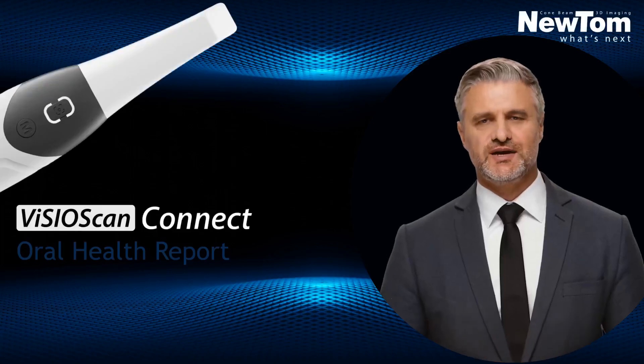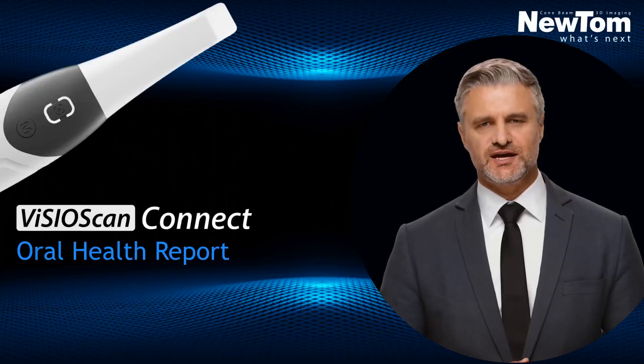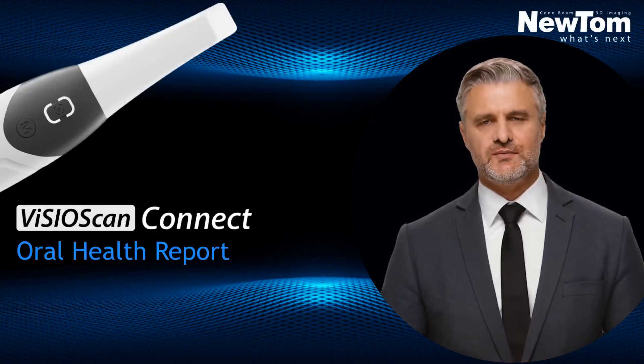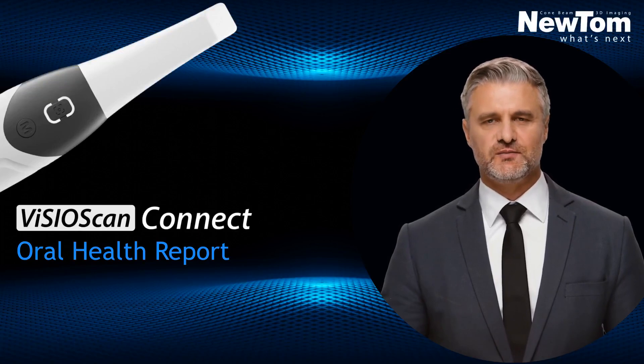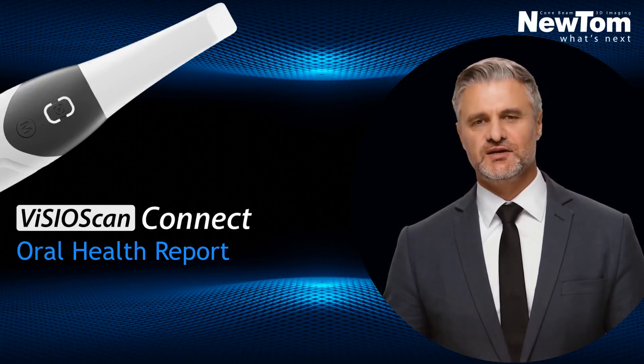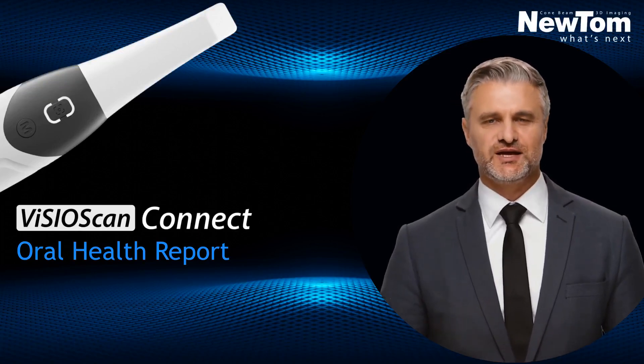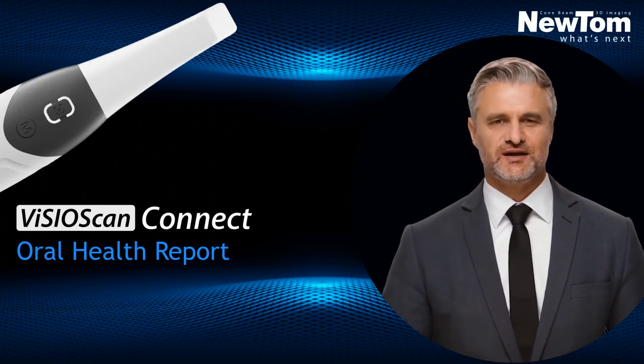Welcome to the NewTOM tutorial section. Let's see how to use the Oral Health Report Communication Tool in the VISIOScan Connect software.